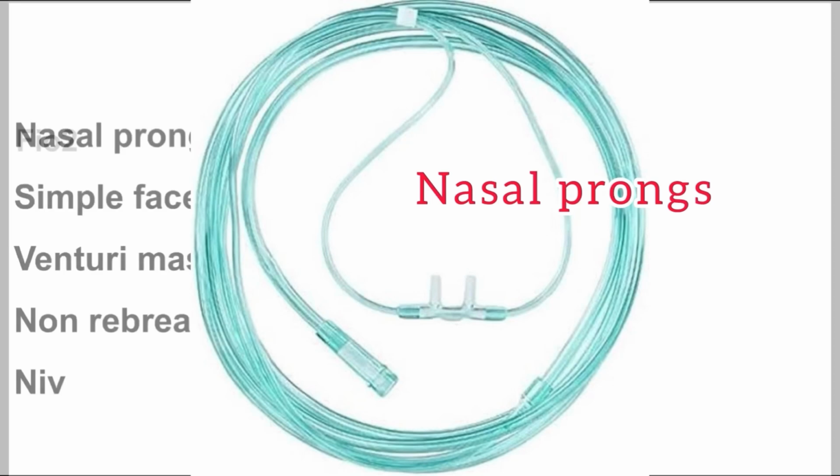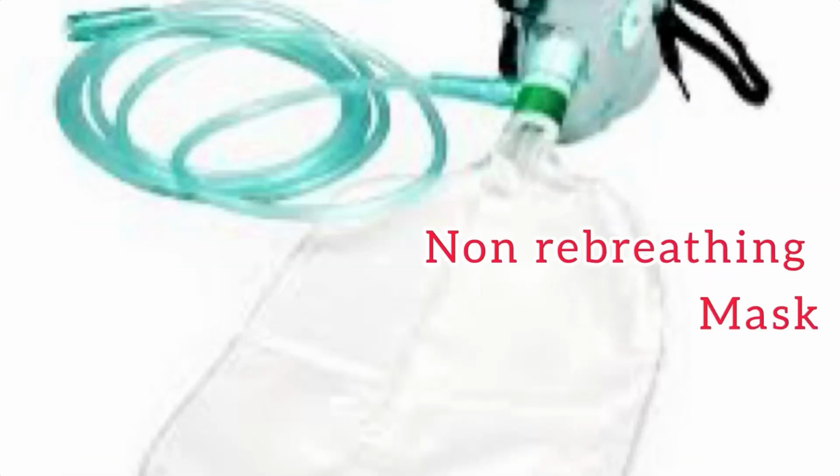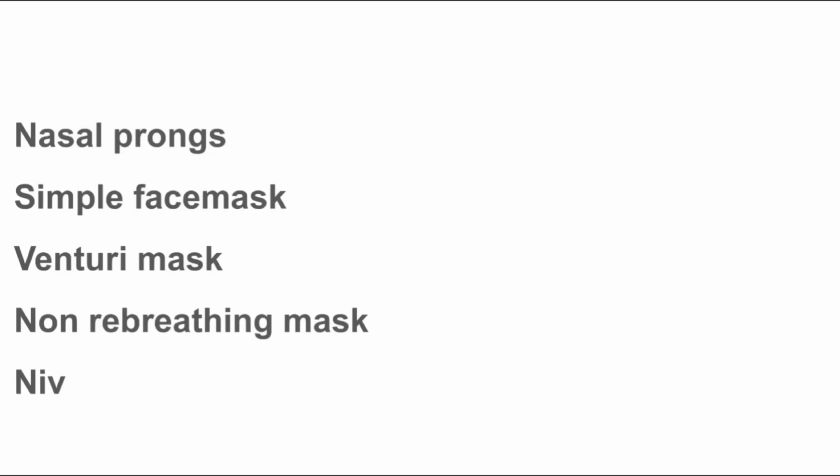But FiO2, the fraction of inspired oxygen that I am breathing in, will change if you use different oxygen devices, and you should know the FiO2 for each device, such as nasal prongs, simple face mask, venturi mask, non-rebreathing mask, and NIV. So now we will discuss a little about these devices because this is also important while solving ABGs.